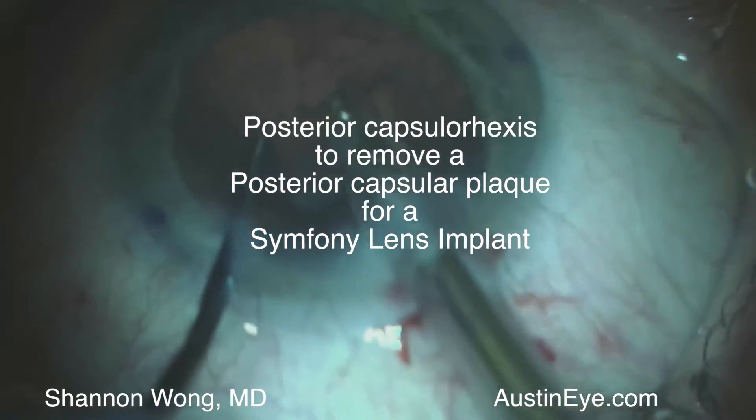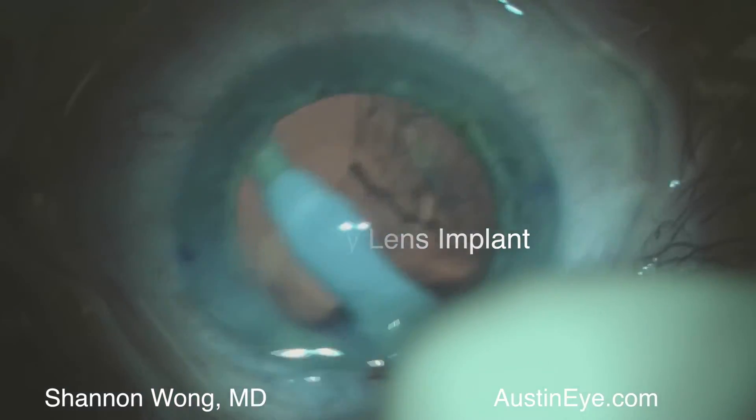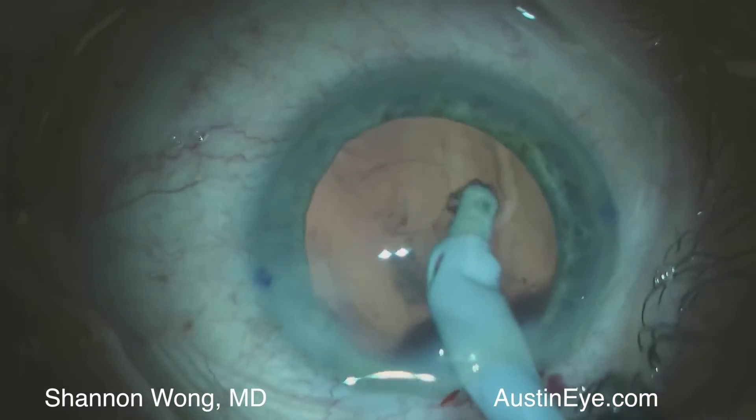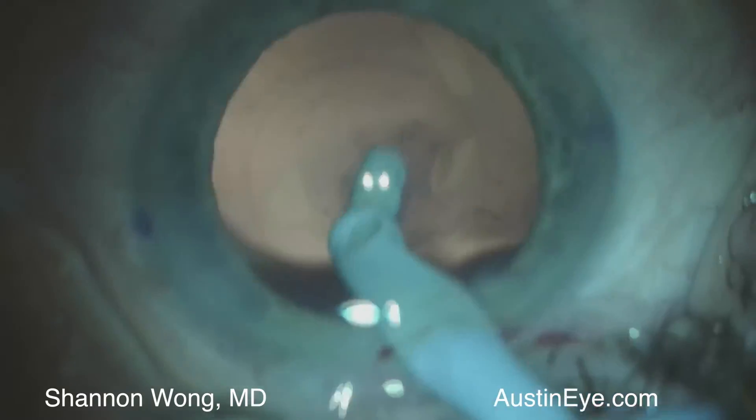Hi, this is Dr. Shannon Wong in Austin, Texas. This is a case of creation of a posterior capsulorexis to remove a posterior capsular plaque.